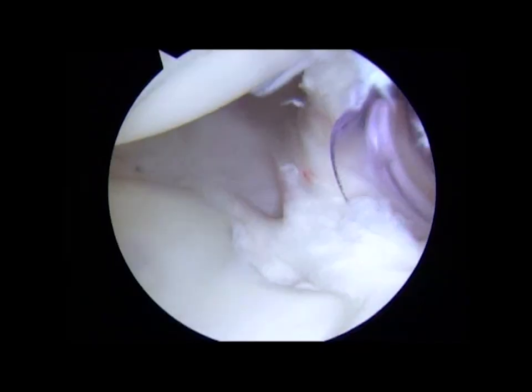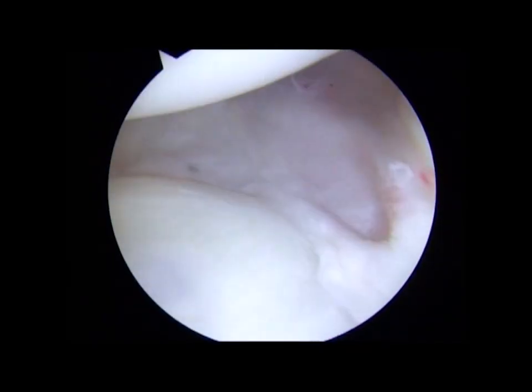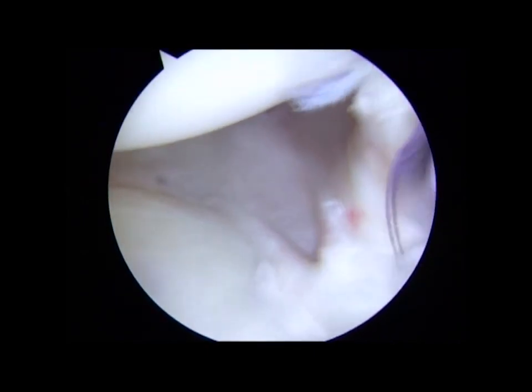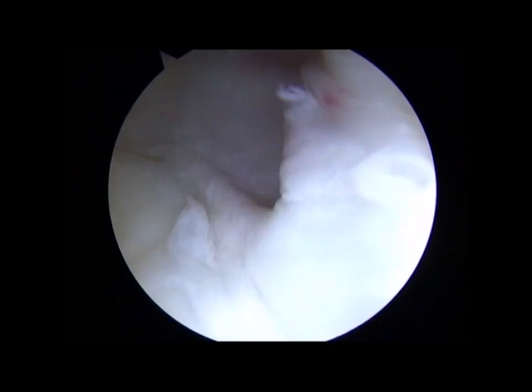When we view from anterior superior in this patient, again, we can see the absence of any labral abnormality despite the high degree of recurrent instability this patient suffers from.